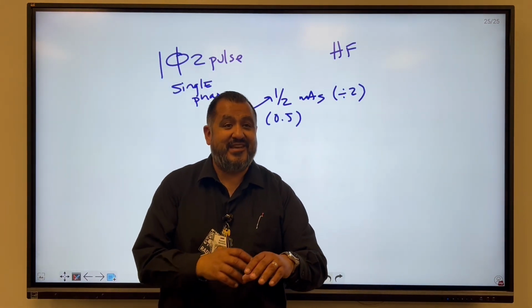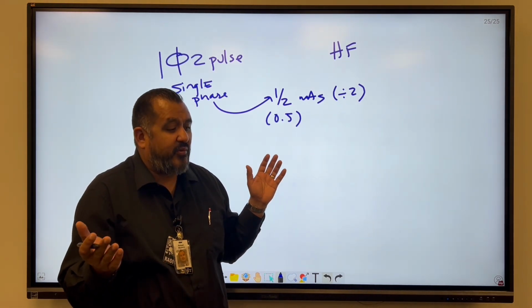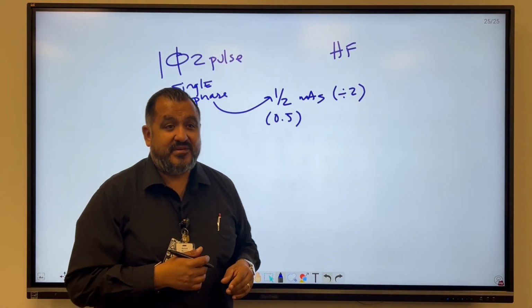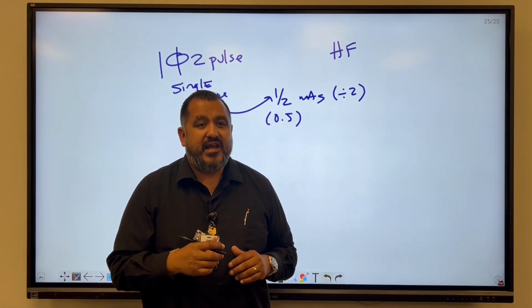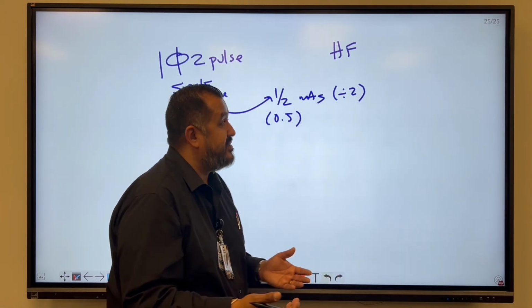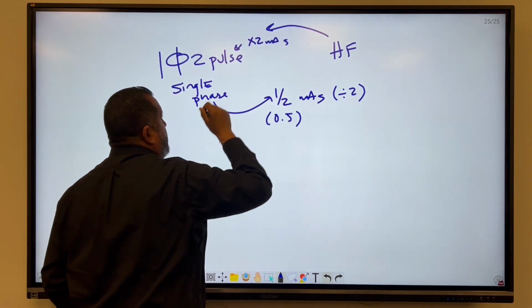take an x-ray, let's say a hand, and in the high frequency system you maybe used, I'm just going to make up a number, 1.6 mAs. In the old school single phase system, you have to use 3.2 mAs for a hand. I'm just making up numbers here. So you're going to have to double your exposure. You would have to double the mAs to use it on an older system.